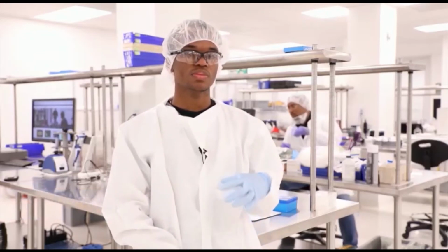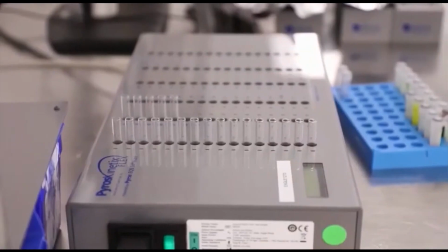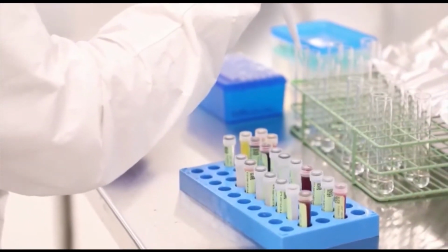To explain more about the endotoxin test, I'll turn it over to our microbiologist here at Eagle. Because of how harmful bacterial endotoxins can potentially be to humans and animals, especially if you're producing medical devices or injectables that come into contact with the bloodstream or spinal fluid, it's essential to test your sample for bacterial endotoxins.